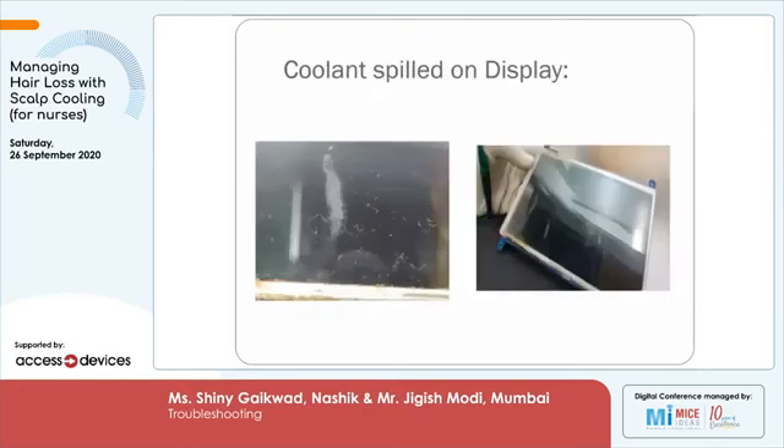You can clearly see the liquid being spilled on the screen. On the right side, you can see water droplets coming down on the screen. Kindly ensure that no liquid is falling on the screen.